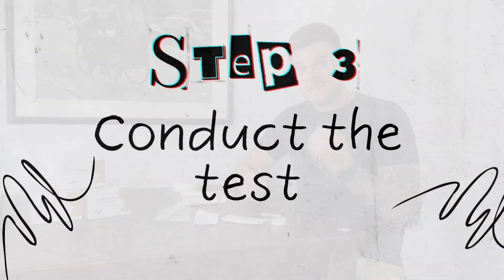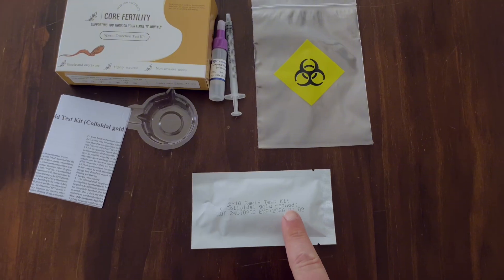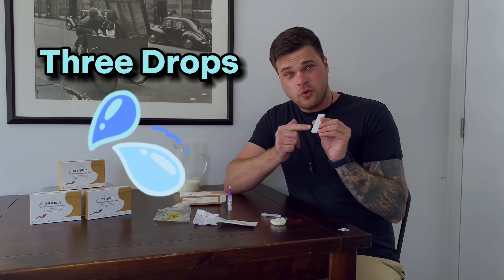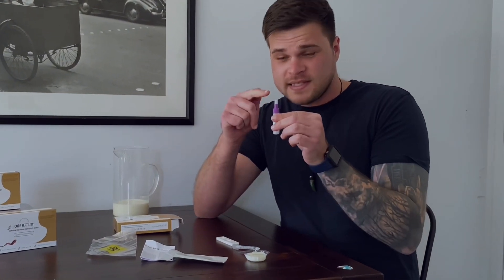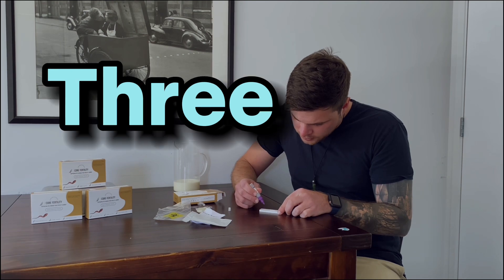Step three: conduct the test. Now we want to grab out the test pad — it should look like this. We want to add three drops to this little circle bit. To do this, just take off the little lid on top of the dilutant bottle and drop three drops in: one, two, three.